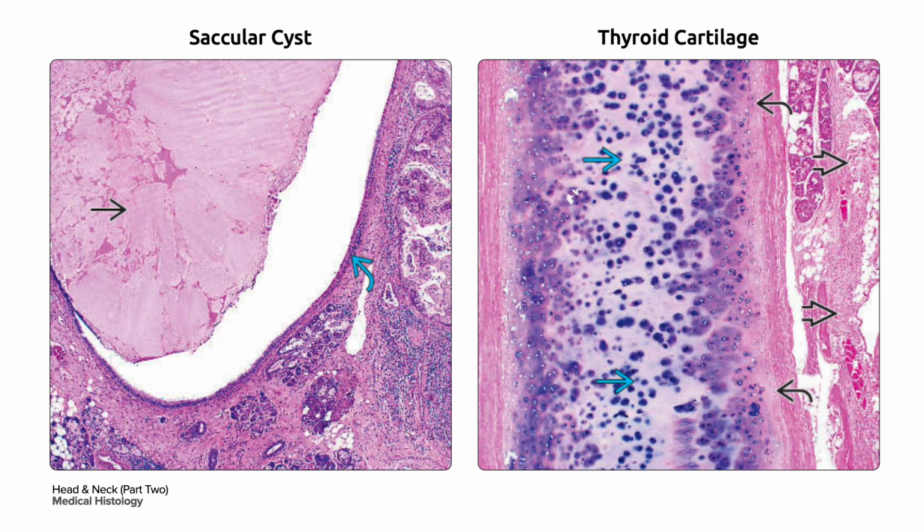On your right, in contrast to the epiglottis, most of the other laryngeal cartilages are composed of hyaline cartilage in single blue arrow with an adjacent perichondrium in curved black arrow. The paraglottic space in bold black arrow can be seen adjacent to the thyroid cartilage.